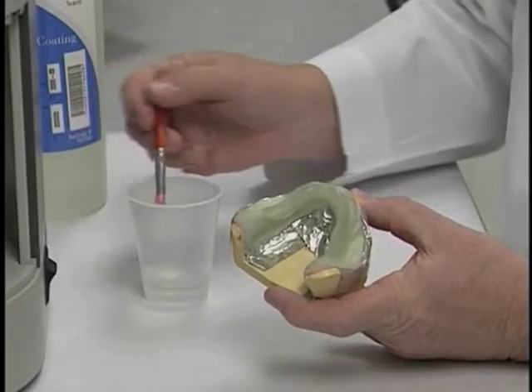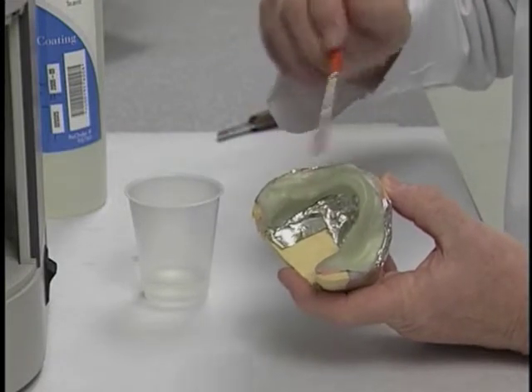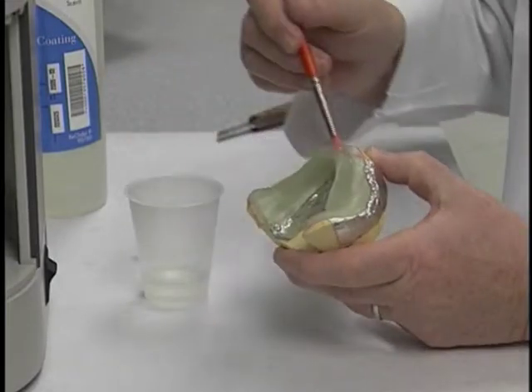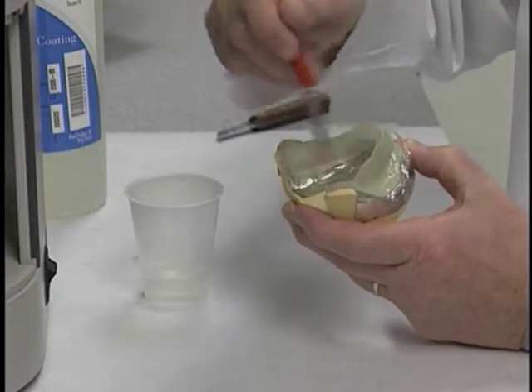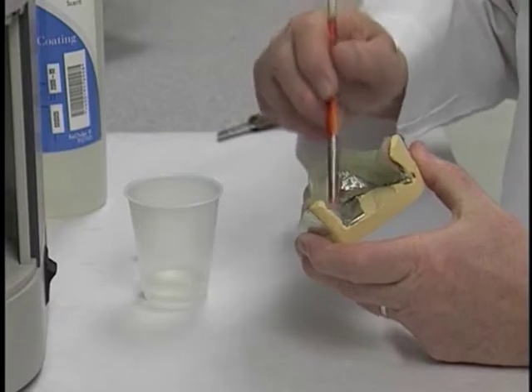For the mandibular tray, we do exactly the same thing. After it has been formed, we paint it with the air barrier. Just put a light coat of the air barrier over all the surfaces, external surfaces of the tray.